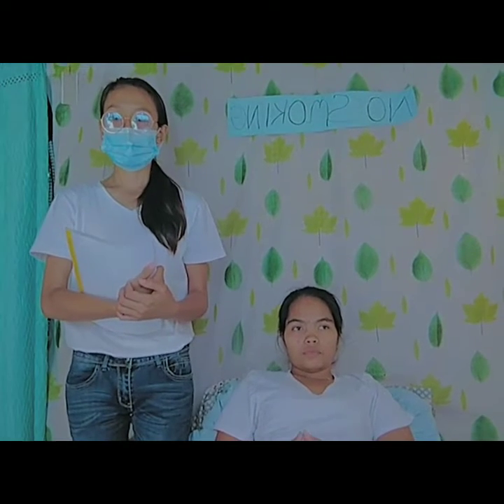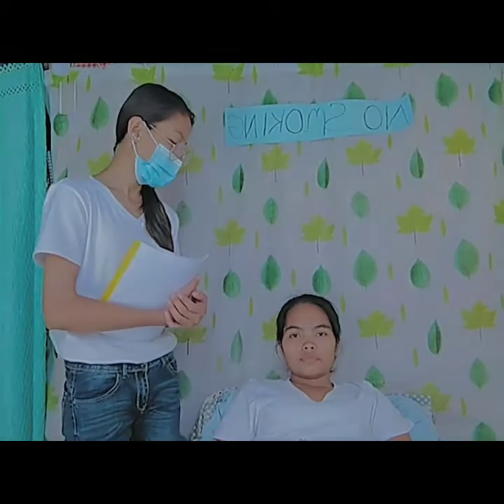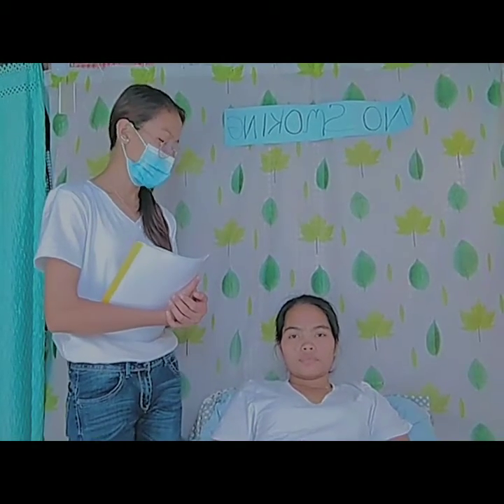Then let's explain to the patient that oxygen will relieve dyspnea or discomfort, and inform the patient concerning safety precautions associated with oxygen use. If the patient is using a cannula, encourage him or her to breathe through the nose. Okay, Mom, later we will use a nasal cannula.